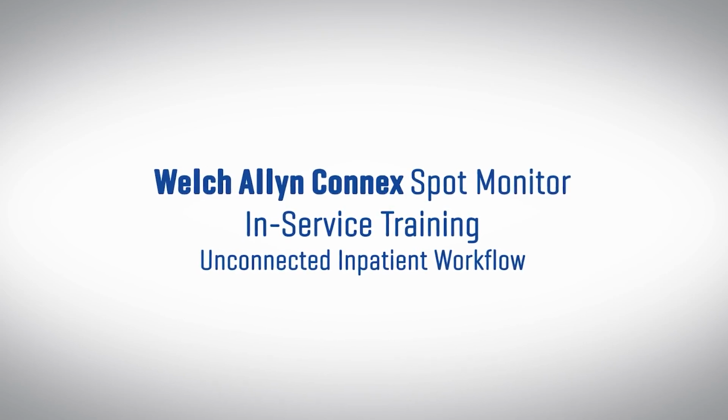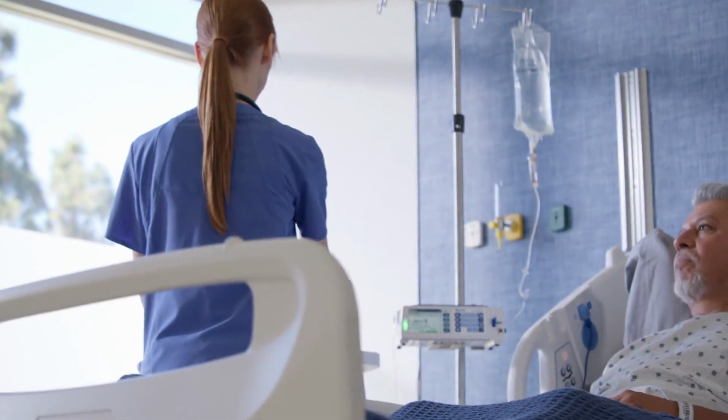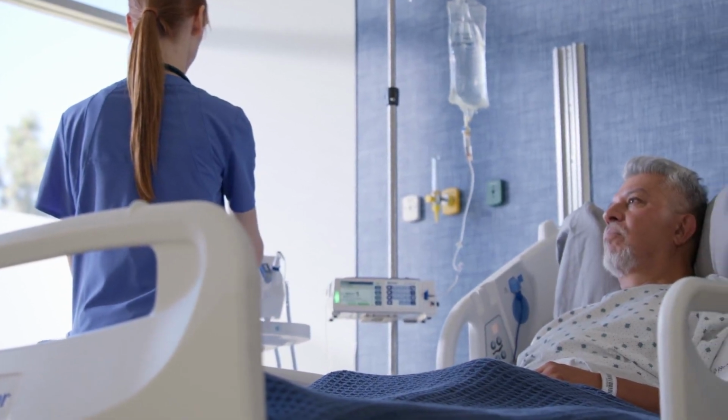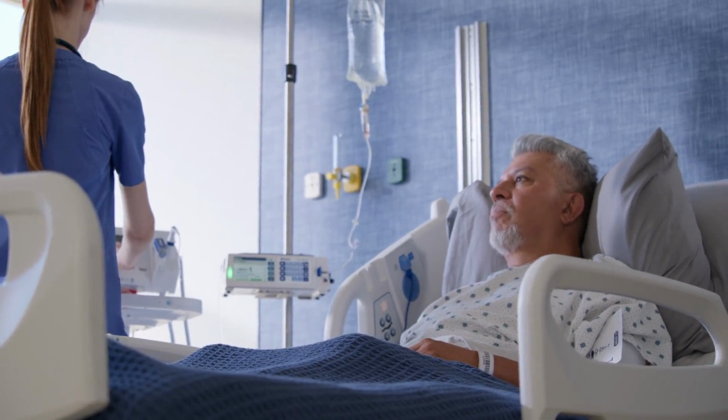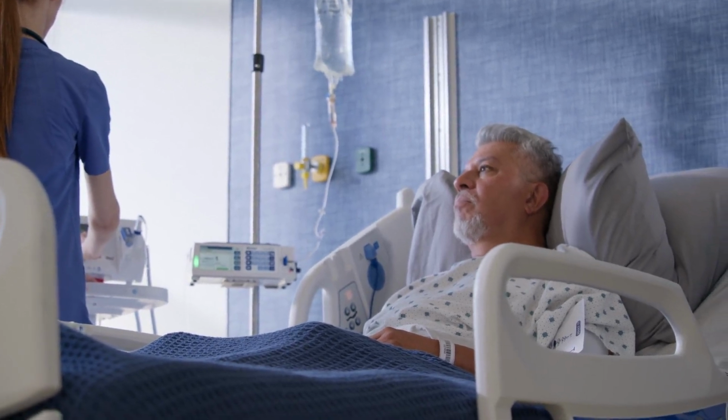Today, we'll review the basic functions and workflow of the Welch Allyn Connex Spot Monitor from Baxter. We'll cover how to navigate the device interface and take a set of patient vital signs.